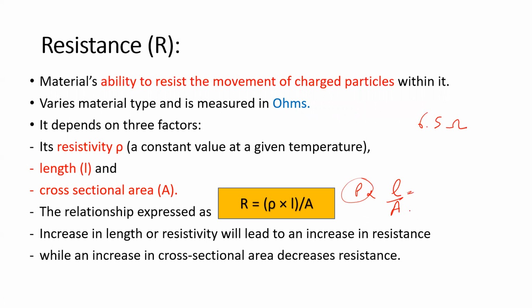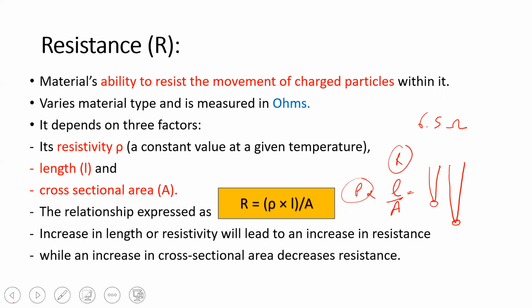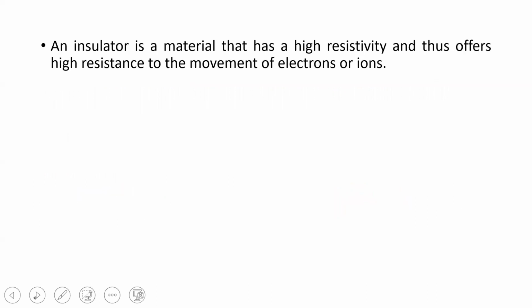Now, let us hammer your brain and just imagine, can the length of a tooth, shorter or longer, influence this resistance? Or can the area of this apical terminus influence it? So, this may be an inquisitive question to you. Let us see how it can influence.